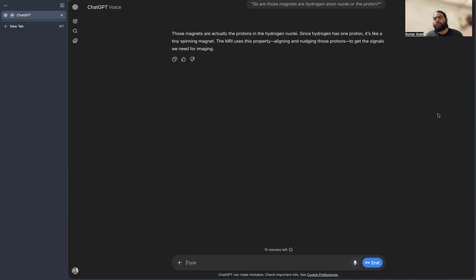So how is that possible? First of all, we make a magnet actually inside our whole human body. At the tissue level or cellular level, you are talking about.